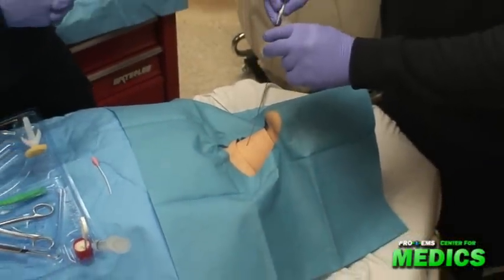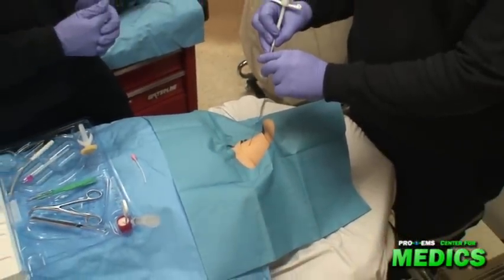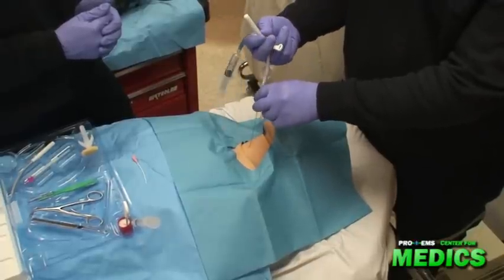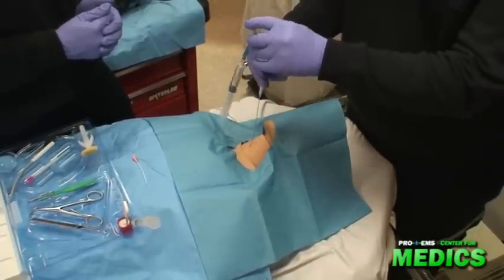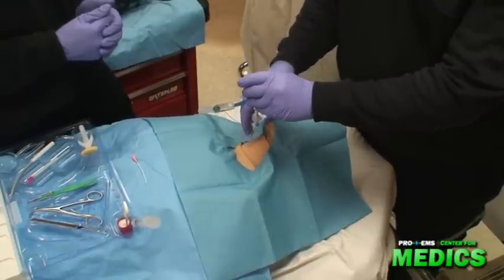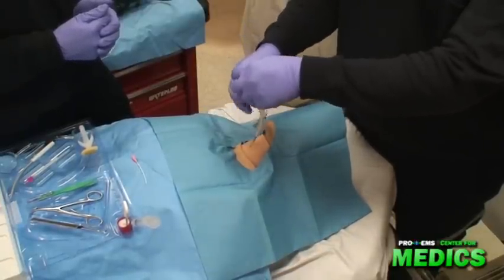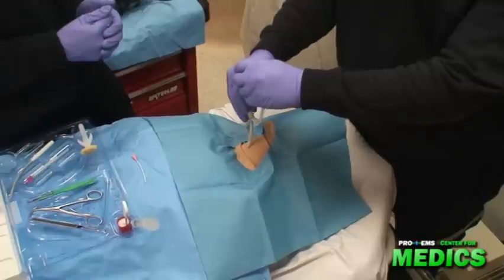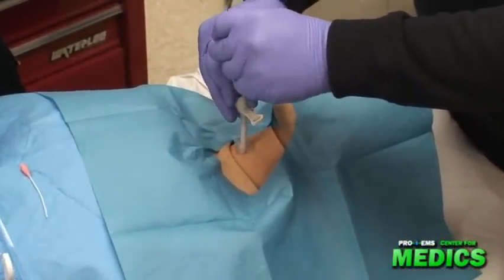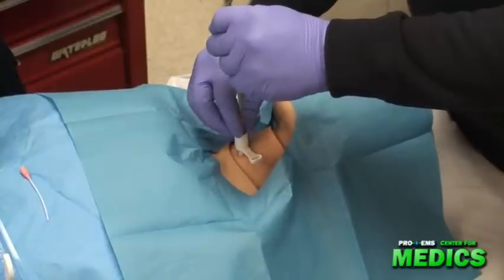I'm going to guide the dilator and the airway assembly onto the wire. I advance the dilator through the skin and the membrane, and I advance the airway until it is flush with the skin.